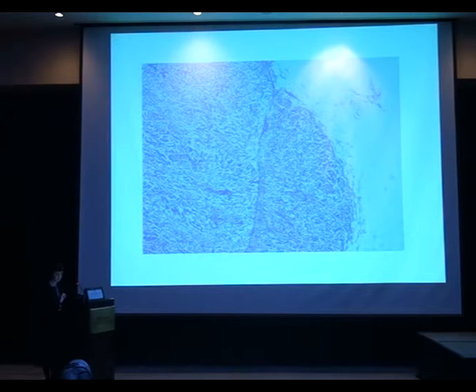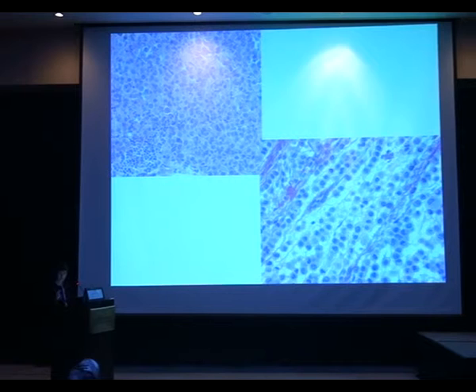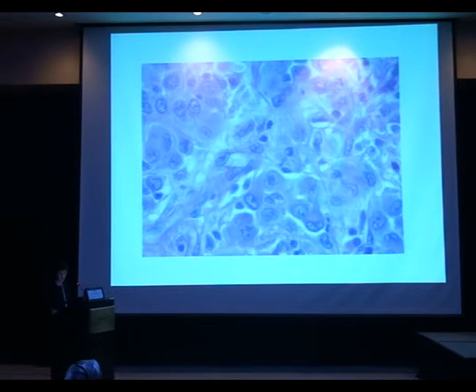This is the aspect of the lesion. So it's a kind of well-circumscribed lesion. Like that, it doesn't look like a breast cancer, but it could be a solid lobular carcinoma if you look from high magnification. It still looks like lobular carcinoma. It could be a solid lobular carcinoma or an undifferentiated carcinoma. When you look at a higher magnification, it's obviously malignant. The cells are very atypical, and we have some intranuclear inclusions.